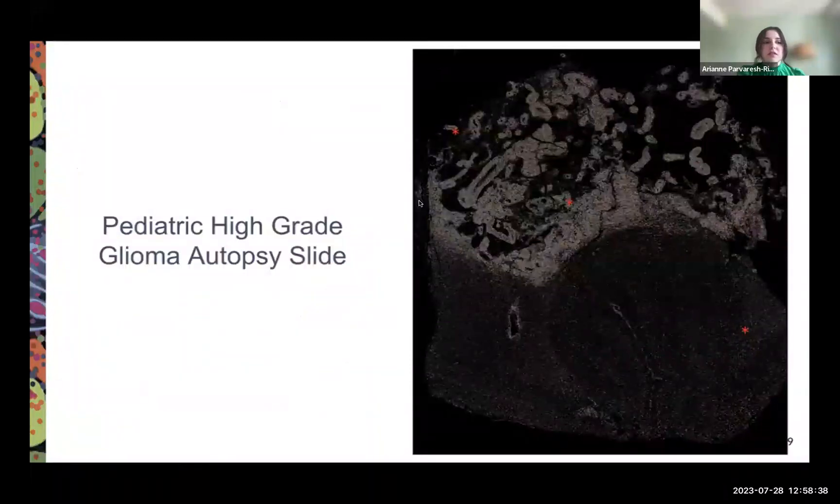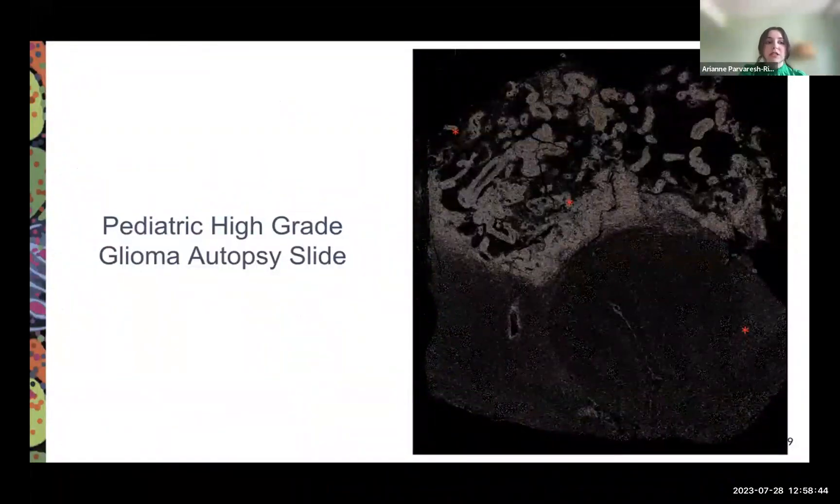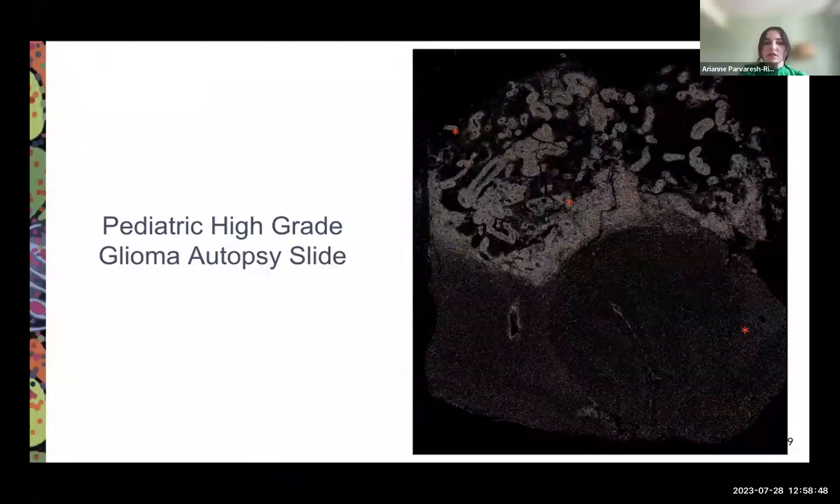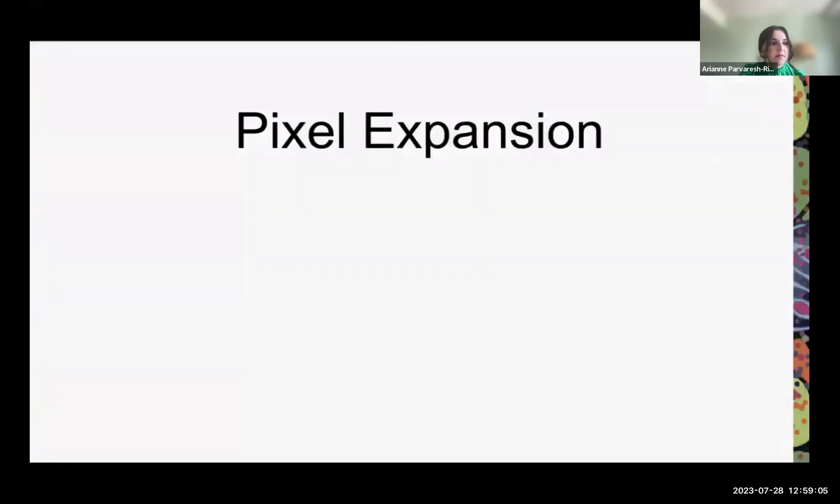For the purposes of this presentation, I'll be presenting a pediatric high-grade glioma autopsy slide that was imaged at the TAN Lab. I'll be representing three regions from this slide. I basically focused on testing three different parameters that MESMER offers: maxima threshold, interior threshold, and pixel expansion, to see how accurately it performs cell segmentation on the slides we have at the TAN Lab.